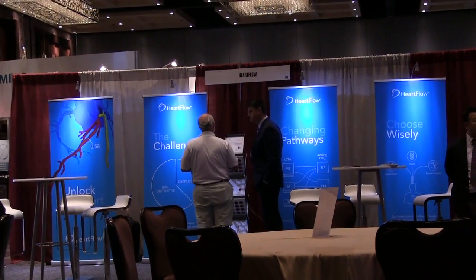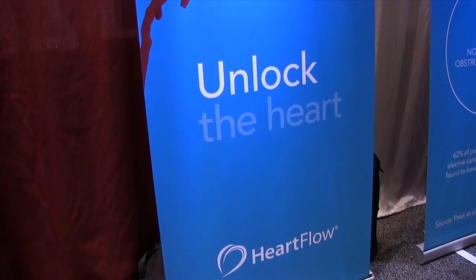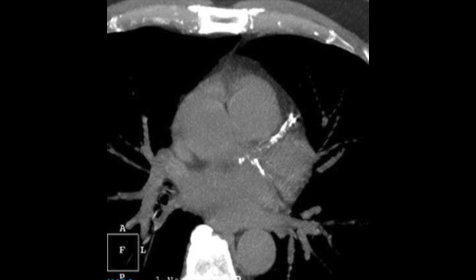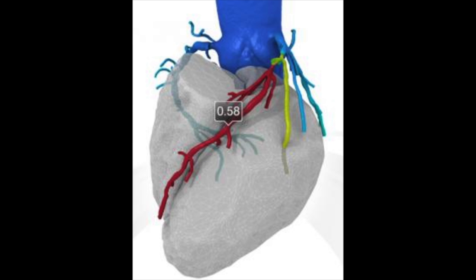One of the hottest topics of discussion at SCCT 2015 was the use of HeartFlow's FFR CT system. This software allows you to take a CT scan and use the data set put through a supercomputing algorithm to derive virtual FFR readings for the entire coronary tree instead of having to use invasive cath lab FFR. This technology is expected to be the new gatekeeper for the cath lab in the coming years, and also a way to non-invasively evaluate a patient with chest pain.